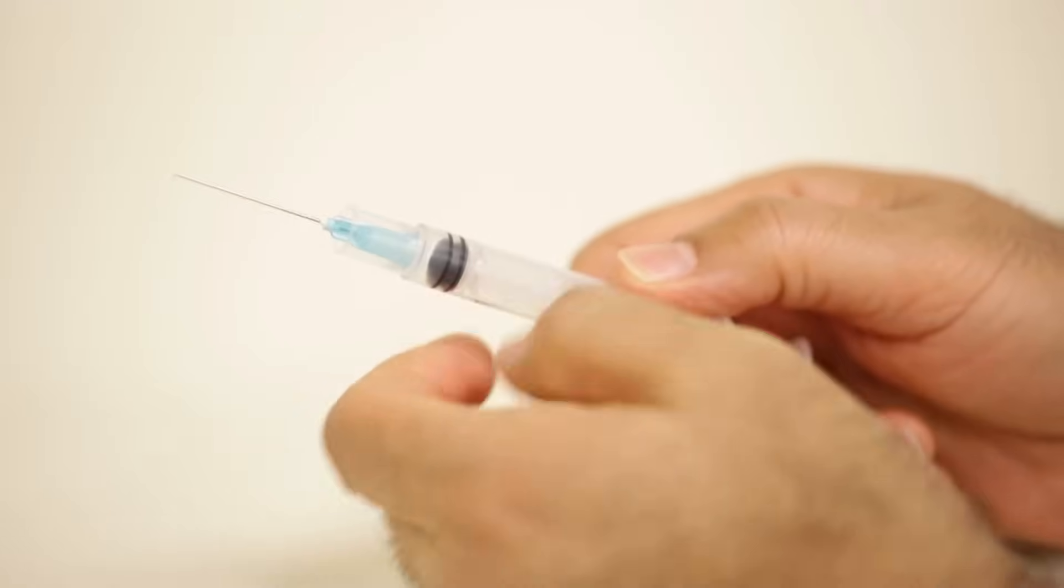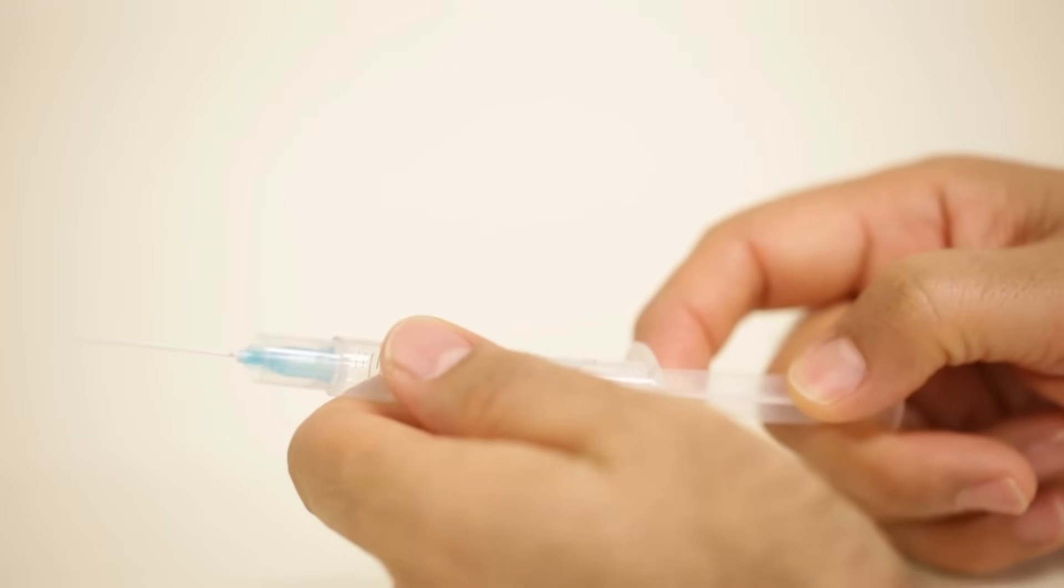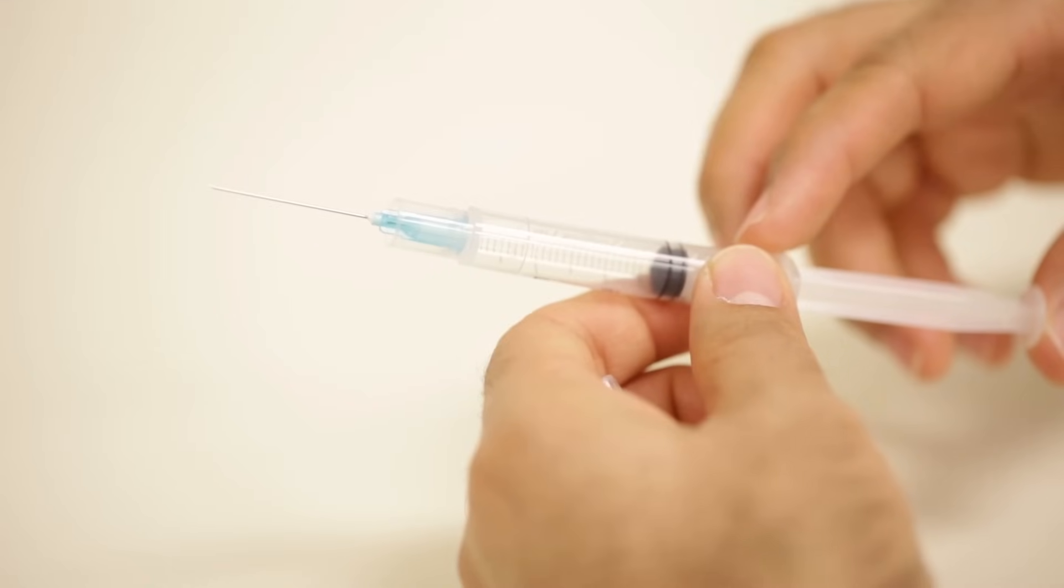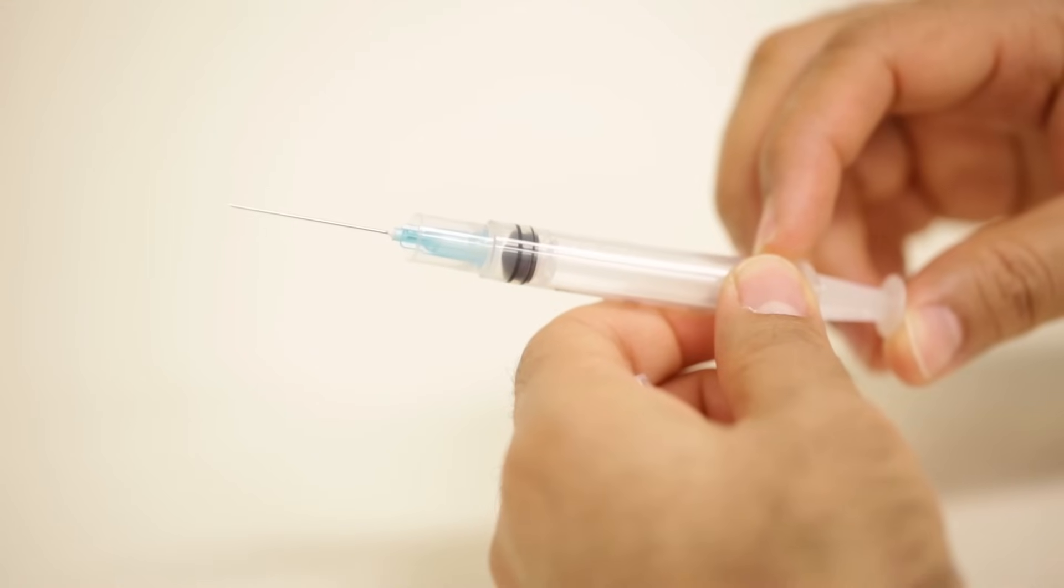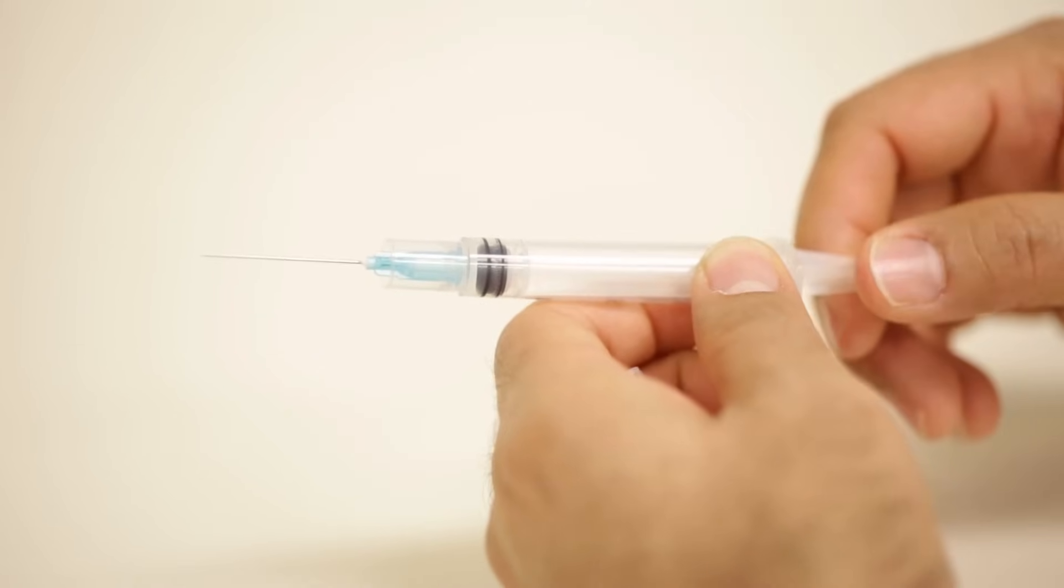This syringe can be used only once. After the injection, continue to push the plunger forward. You will feel a bit of resistance towards the end of the barrel. Continue until the syringe is locked.